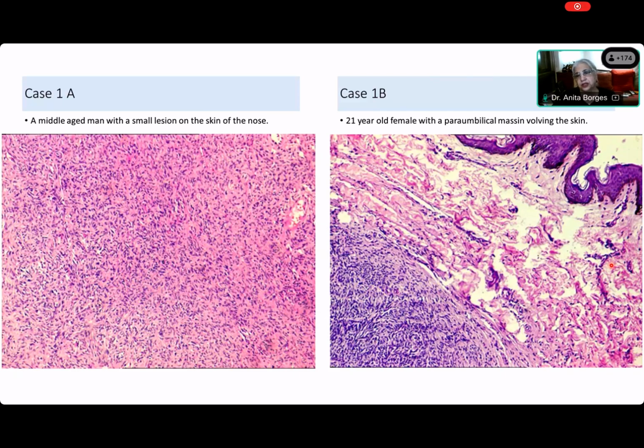I can give you one. Have you ever seen a psammoma body? Yes, ma'am. So what is a psammoma body? Ma'am, these are concentric lamellated calcifications. So you're using the word concentric, right? And have you seen something like that over here, Saida? No, ma'am. Concentric is when something goes completely round, then the next layer goes completely round, then the next layer goes completely round. If you tell me that this looks like that, then I will agree that it is concentric. Is it concentric? No, ma'am.